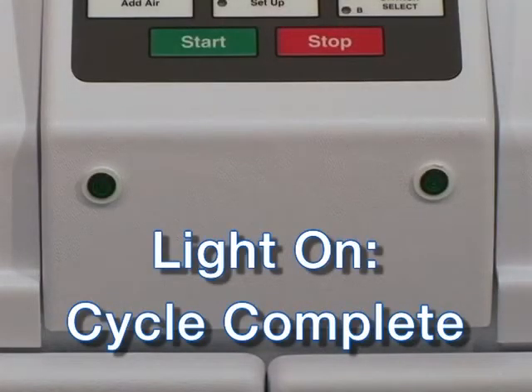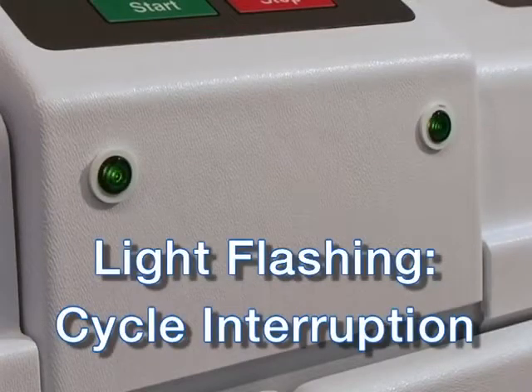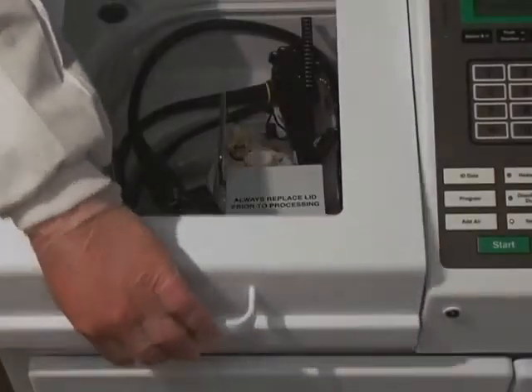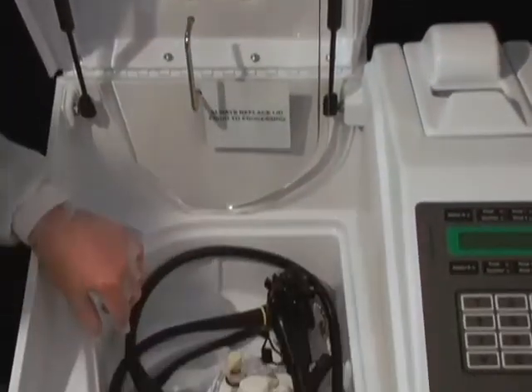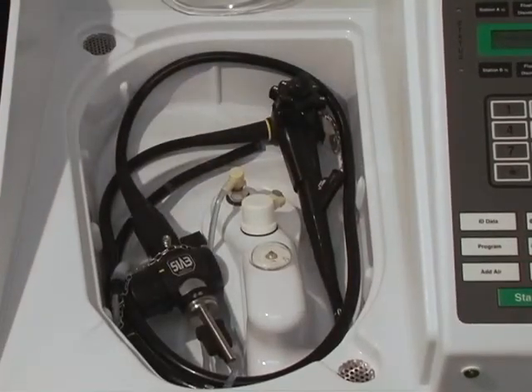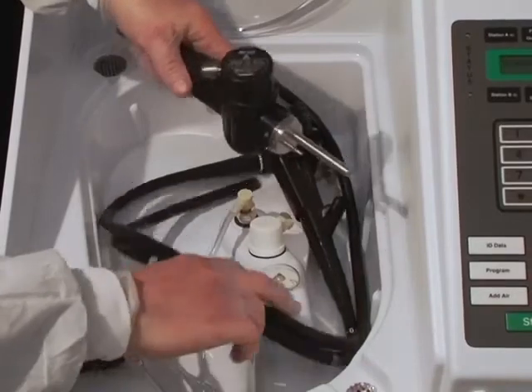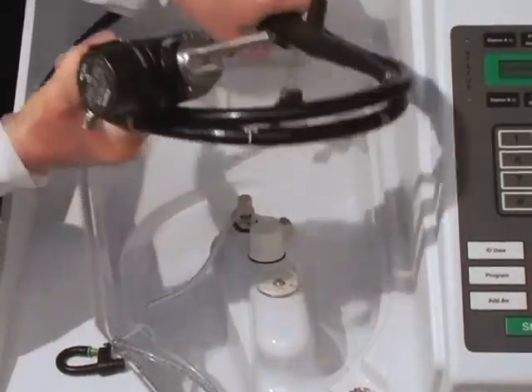When the disinfection process is complete, the process indicator light on the front panel will turn on. The indicator light will flash intermittently if there has been a cycle interruption. Open the basin lid, remove the floating lid and store it behind the lid supports, remove the accessory bag, and dry and store the parts. Remove all connectors from the endoscope, then remove the endoscope from the basin. If the endoscope is being stored, thoroughly dry all surfaces with a clean, lint-free cloth.